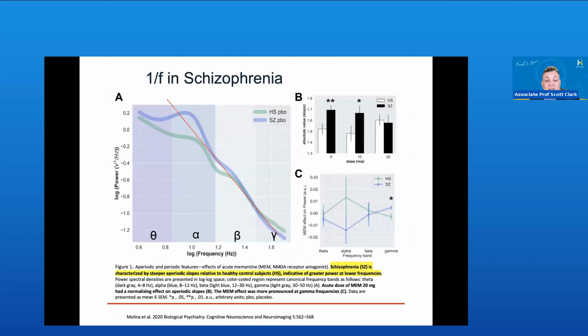And what that does is because there's a reduction in fast spiking waveforms, fast oscillations, the whole curve is shifted upwards, suggesting that there's greater power at lower frequencies because the faster frequencies have reduced.